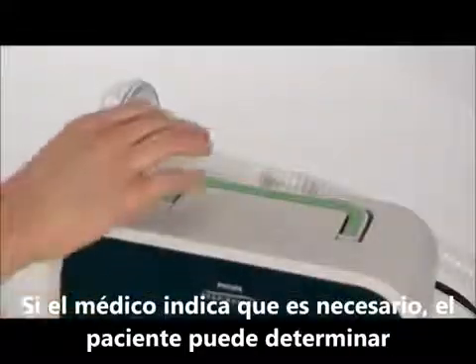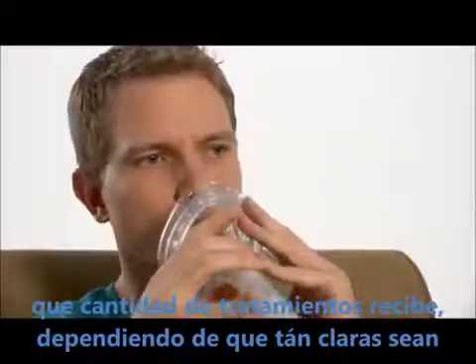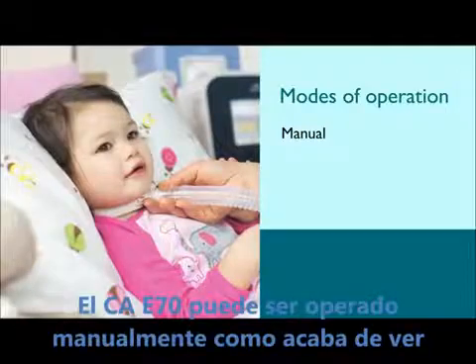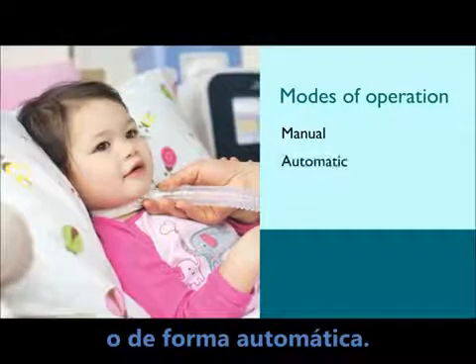If the doctor orders the treatment as needed, the patient can determine how many treatments he receives during the day, depending on how often he needs to clear secretions. CoughAssist E70 can be operated manually, which you have just seen demonstrated, or in automatic mode.